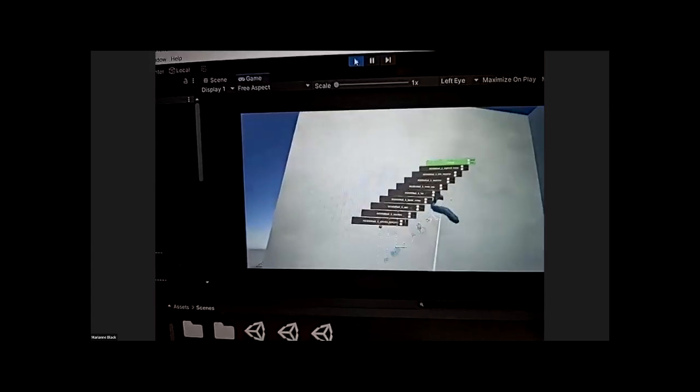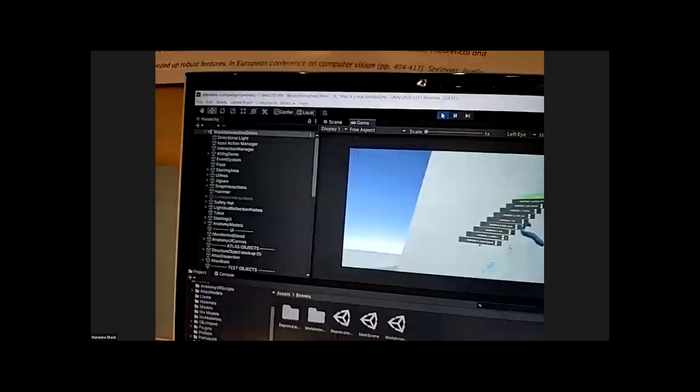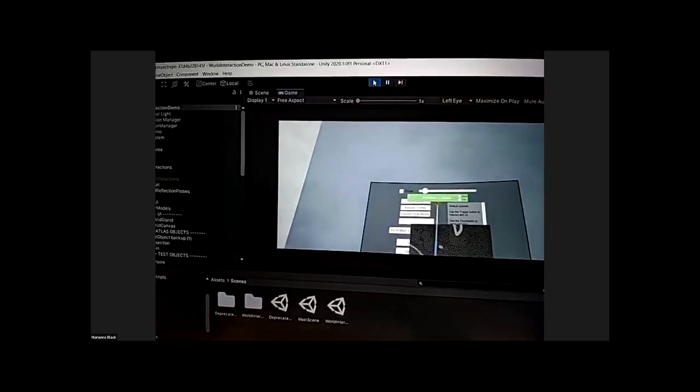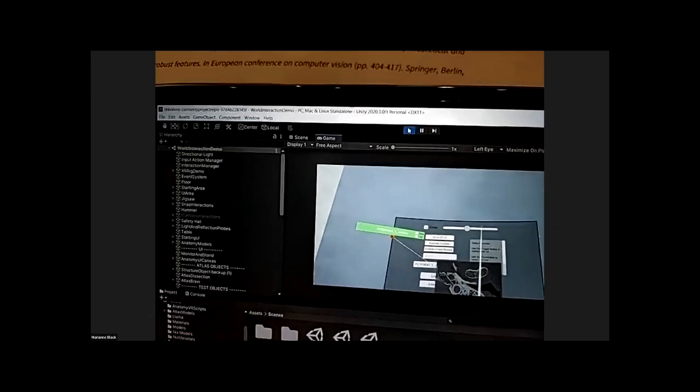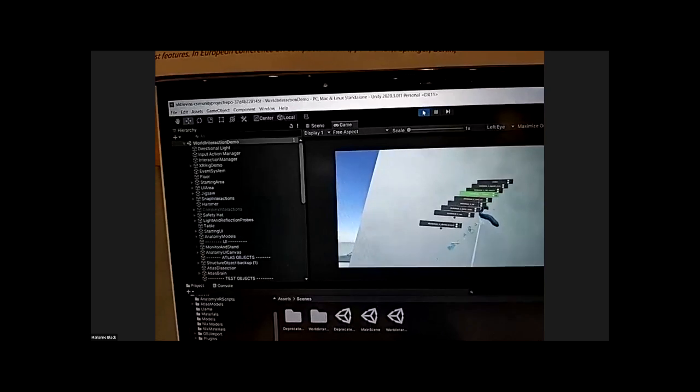And then you can drag any of these structures, say, okay, let's see the cochlea. I'll get it over here, and then I can bring it closer to me, and I can drag it here. And then let's move this. When you go through the different scans, you can get to where the cochlea is actually located. And you can also have other structures overlaid. This is super cool. Yeah, this is an amazing app.